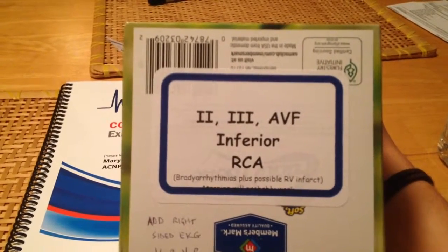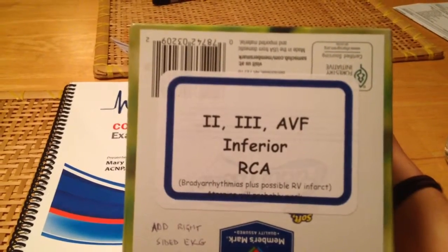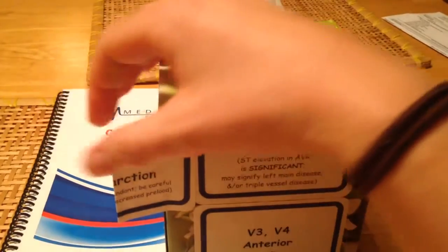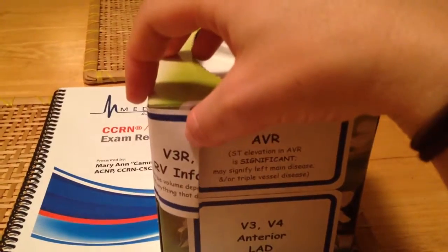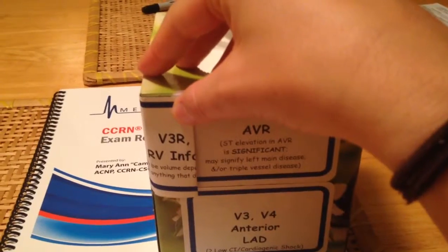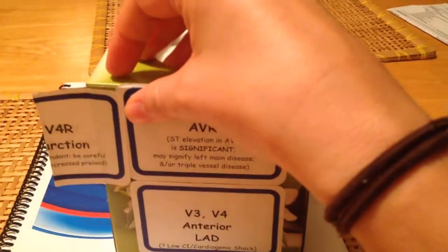Also, if you're having an inferior MI, you might also consider doing a right-sided 12-lead EKG, which is why I have a little sticker hanging off the side here that says V3R and V4R. If you are having ST elevation in those leads on a right-sided EKG, you know that you might be having a right ventricular infarct, which is treated by fluids.